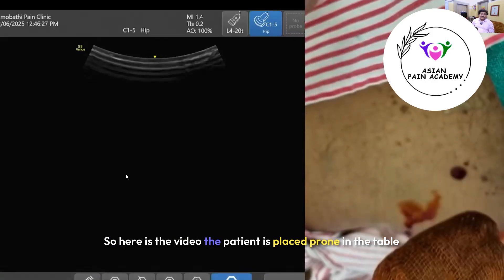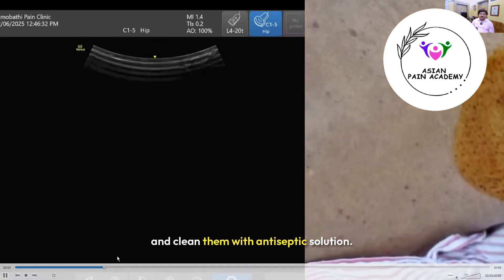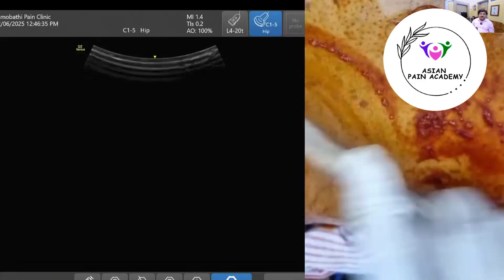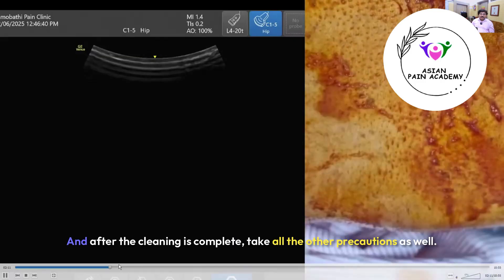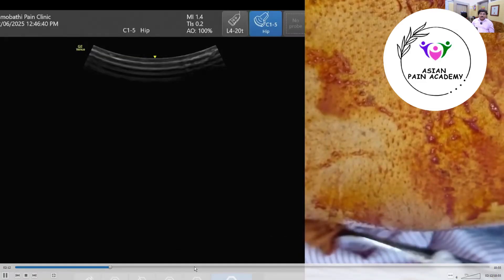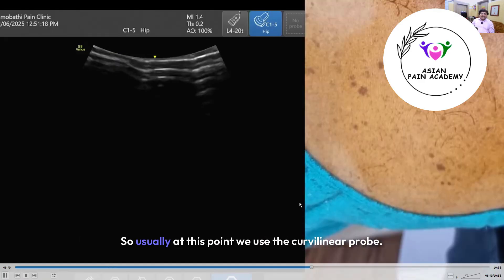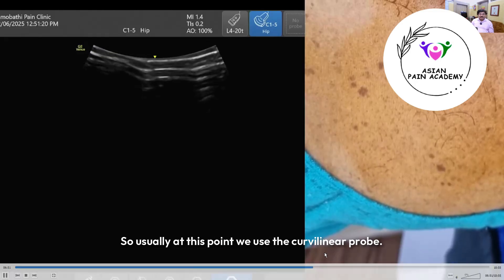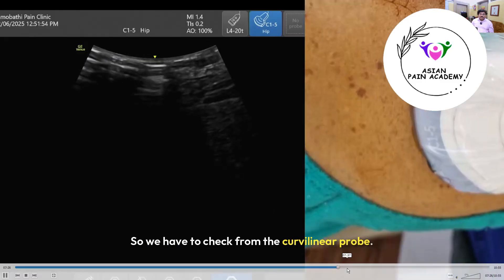The patient is placed prone on the table and cleaned with antiseptic solution — here we are using betadine solution. After cleaning is complete, take all other aseptic precautions as well. Use a probe cover for the ultrasound probe and start scanning. We use a curvilinear probe because the piriformis is a deeper structure.